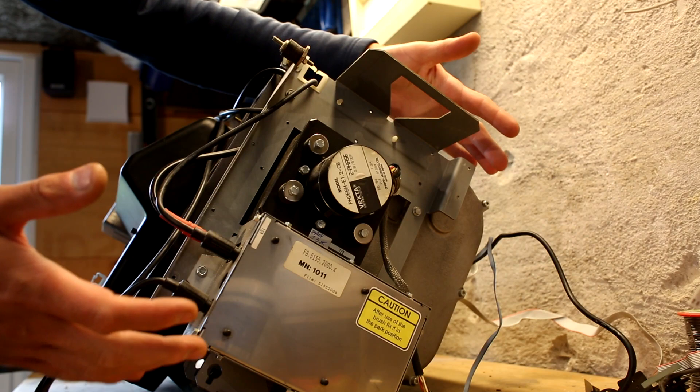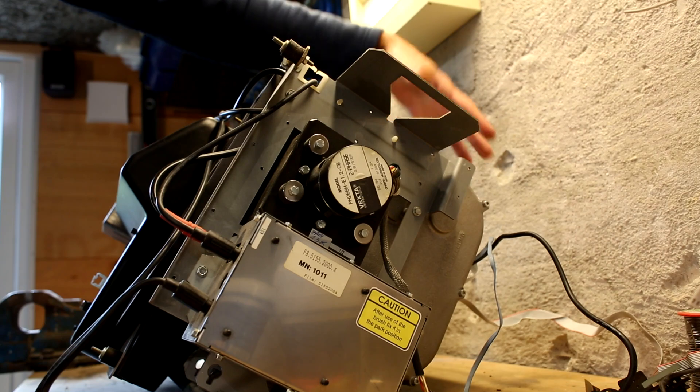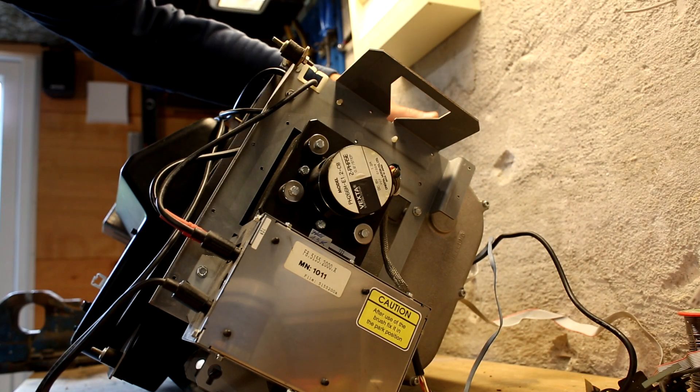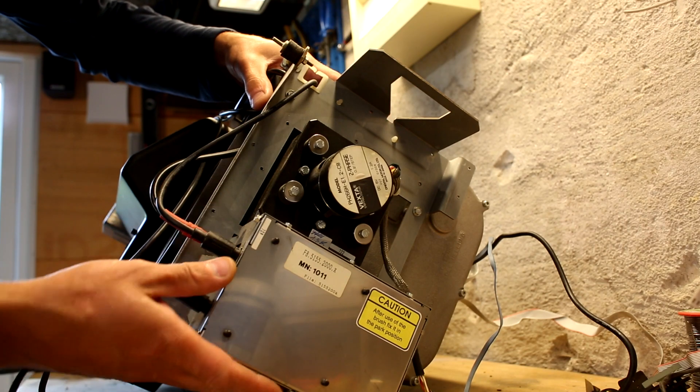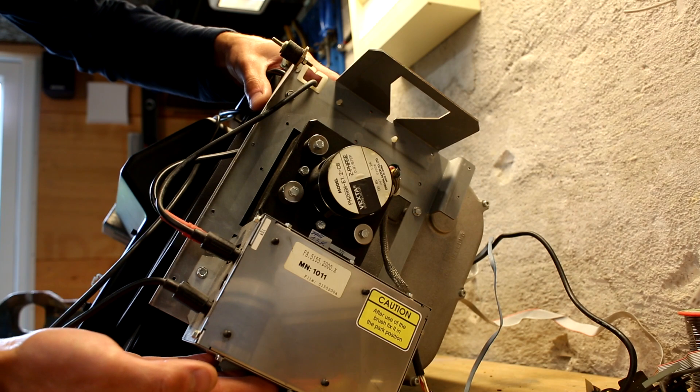On the right side of the unit, we have the stepper motor that drives the whole large gearbox here, which drives the X-ray image plate through the whole scanner unit. Underneath it, we have the high voltage power supply for the photomultiplier tube.